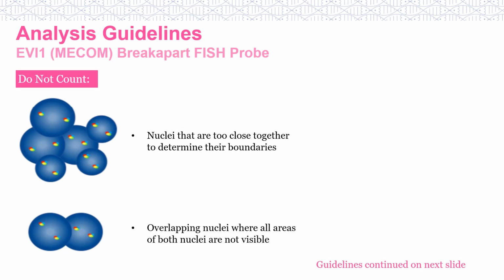Now let's review the general analysis guidelines that are specific to tricolor break-apart FISH probes.